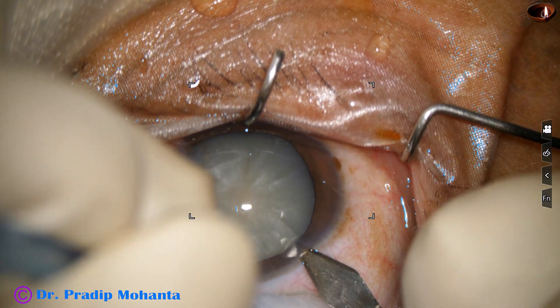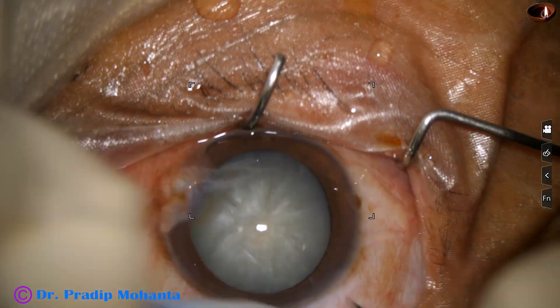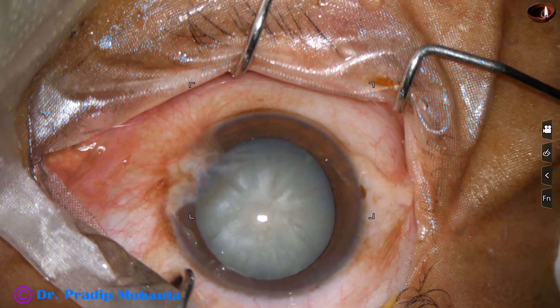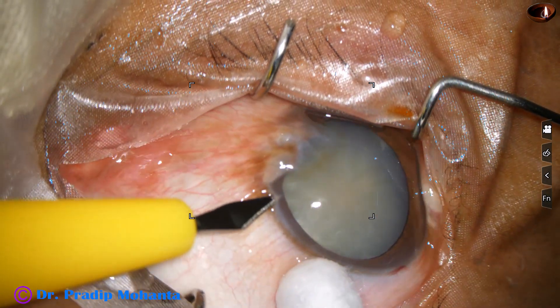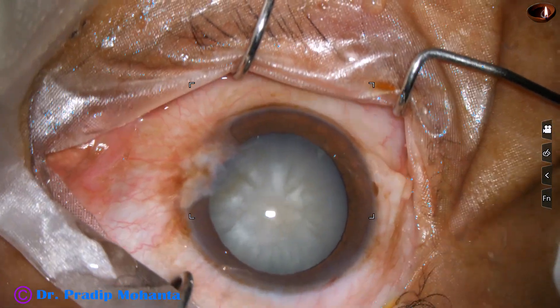This is the main incision with a 2.8 millimeter steel keratome. This is a side port on the left side of the main incision, about three o'clock hours away.